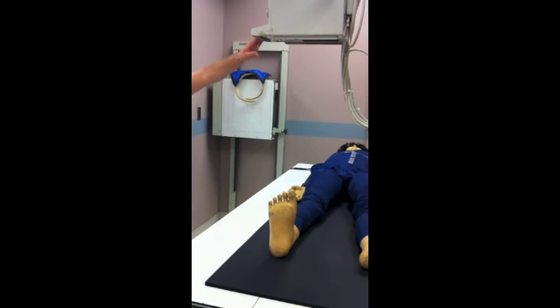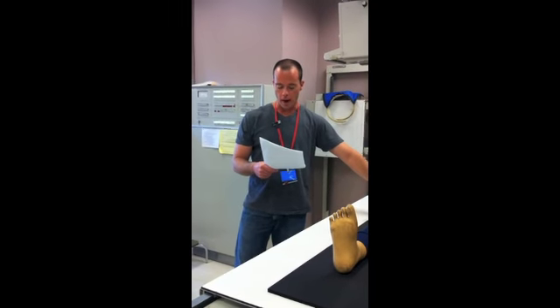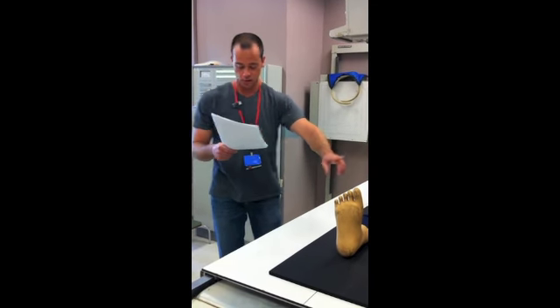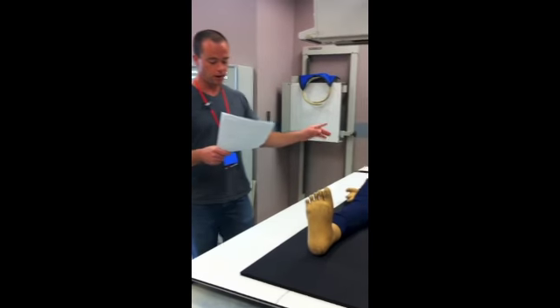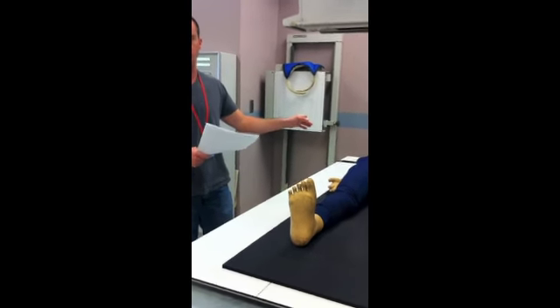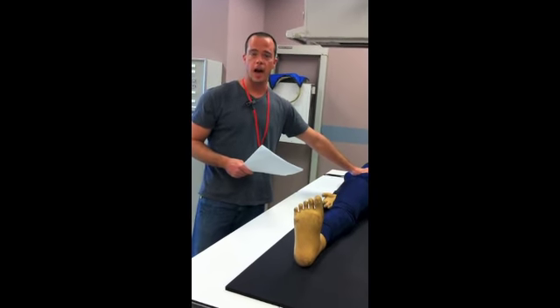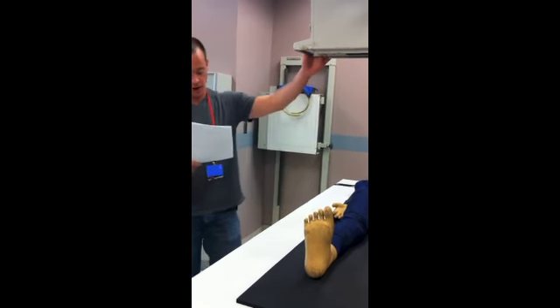You angle the tube according to the patient's body type. You angle 3 to 5 degrees caudad for a thin pelvis, 0 degrees for a medium pelvis, and 3 to 5 degrees cephalic for a thick pelvis. Homeboy is a completely average adult. So we're going to leave it at 0 degrees angulation.